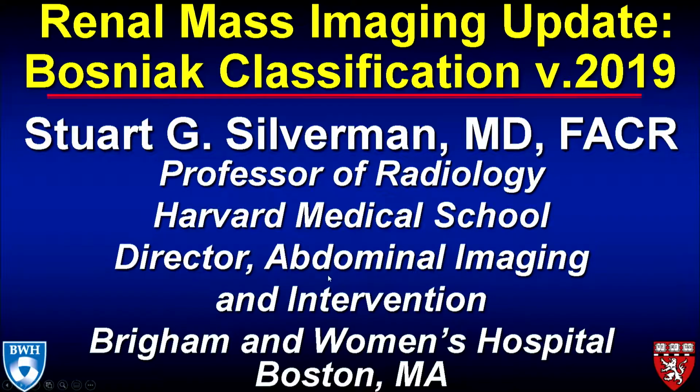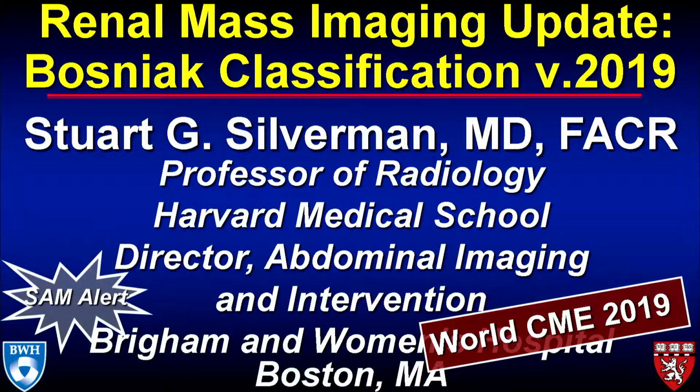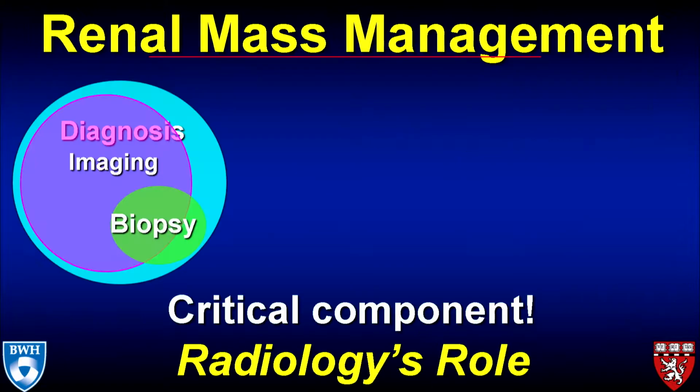Try to spend a good amount of time on the recent update of the Bosniak classification. But a lot of this is going to be to really explain what the problems are in renal mass imaging. So this is a SAM, of course. You'll see little SAM alerts. Pay attention to those slides in particular.